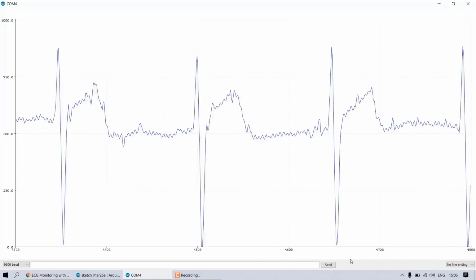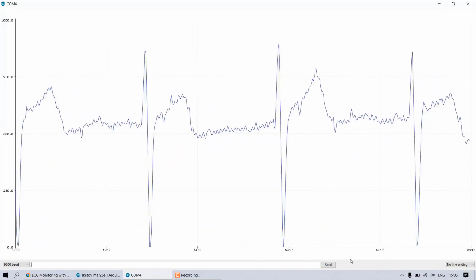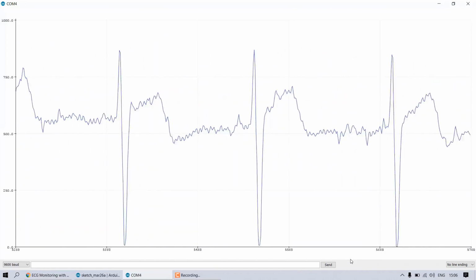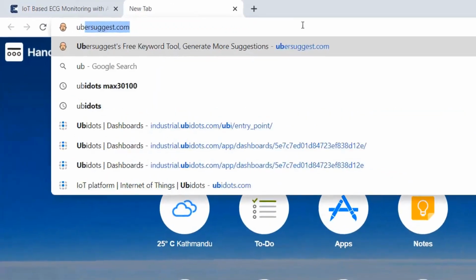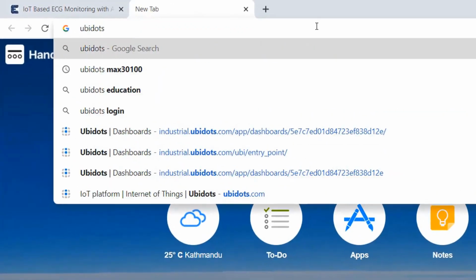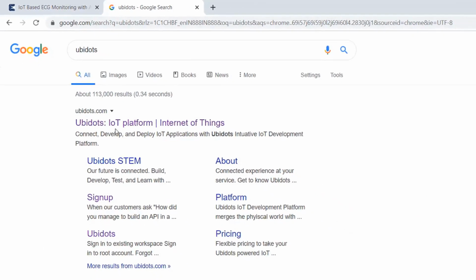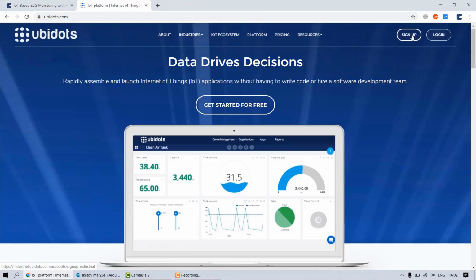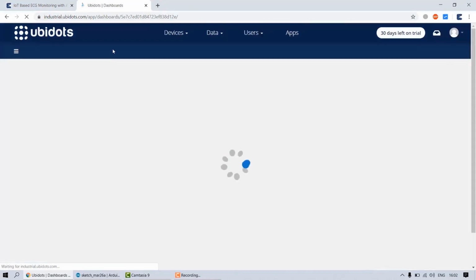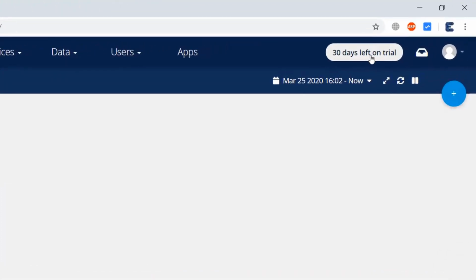Now what I want is to upload this ECG signal to an IoT cloud platform where I can monitor the ECG signal online from any part of the world. For that, I chose Ubidots. Ubidots is one of the biggest and great platforms for IoT projects. So just visit ubidots.com, simply create an account or log in if you had an account earlier. I created the account today, so I am getting a trial of 30 days. You can purchase the license from them as well.